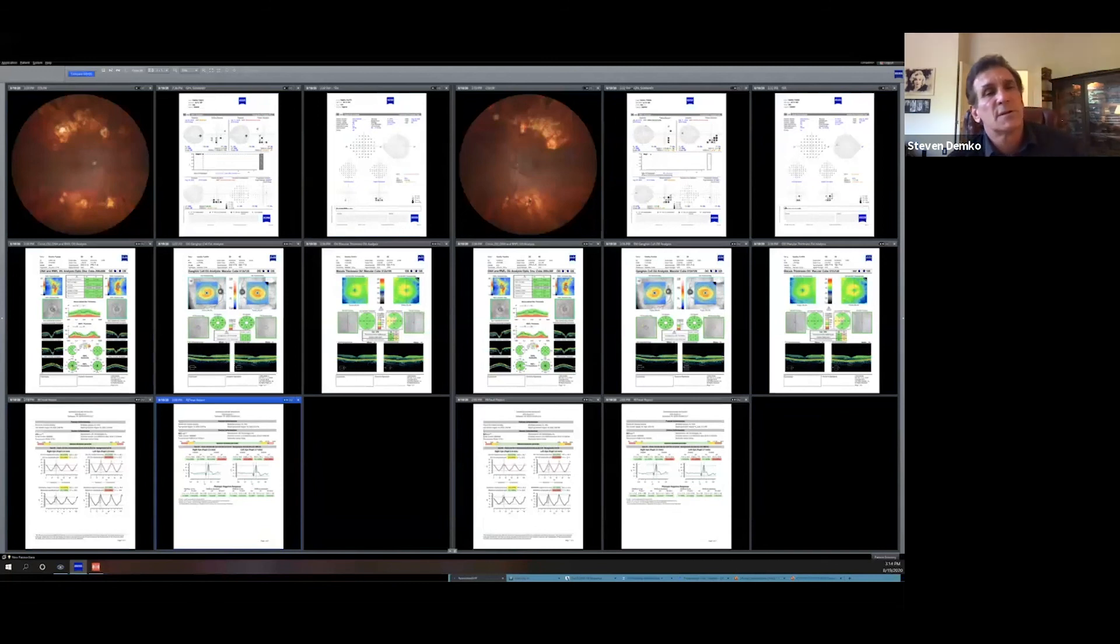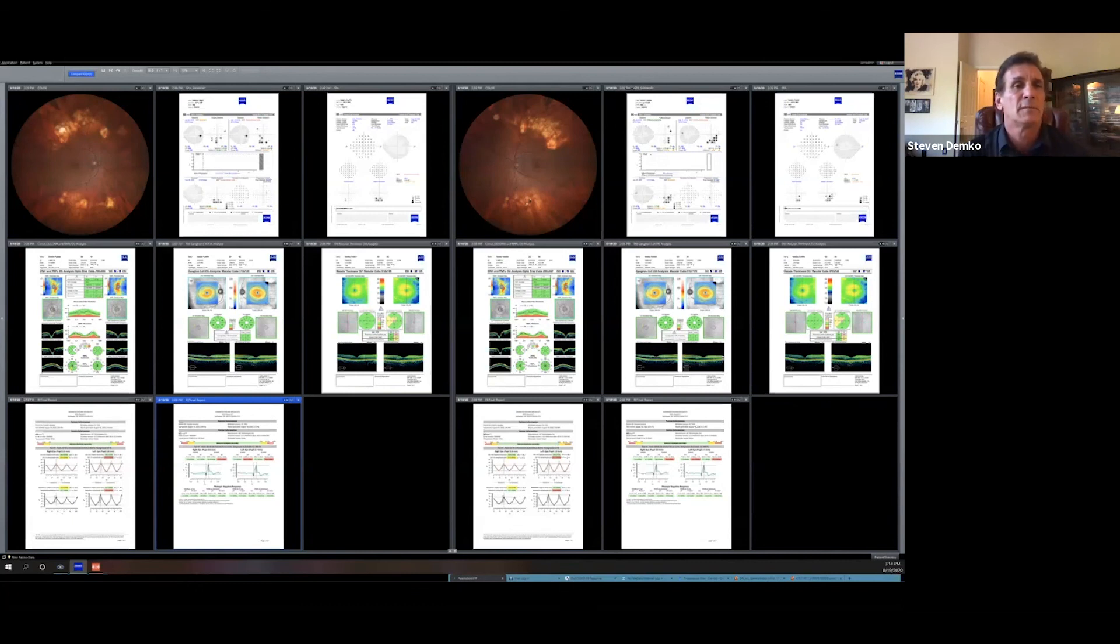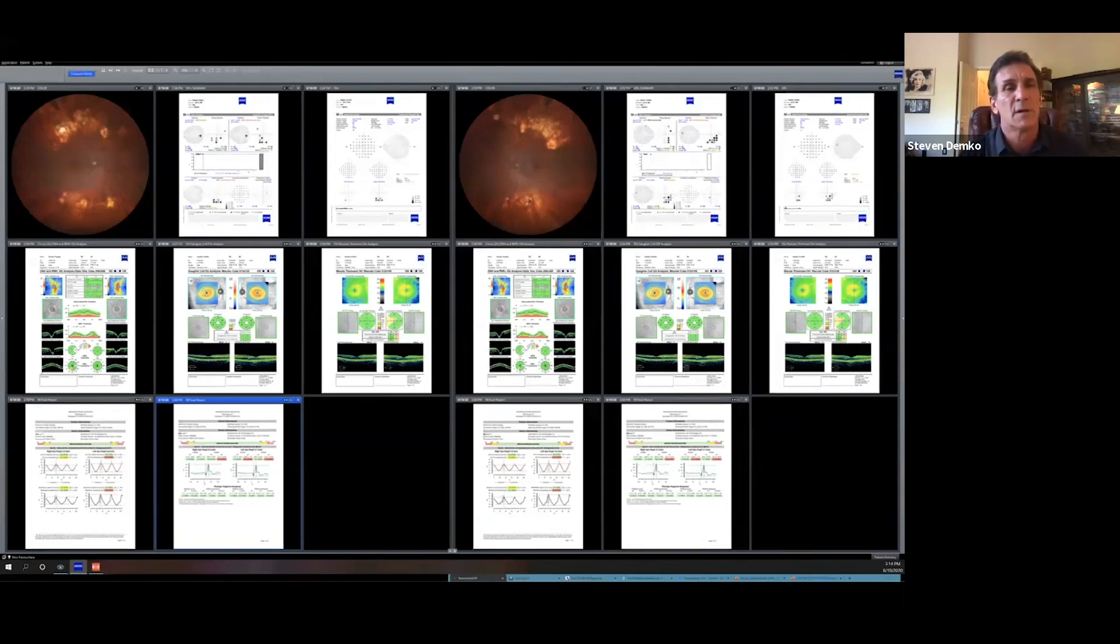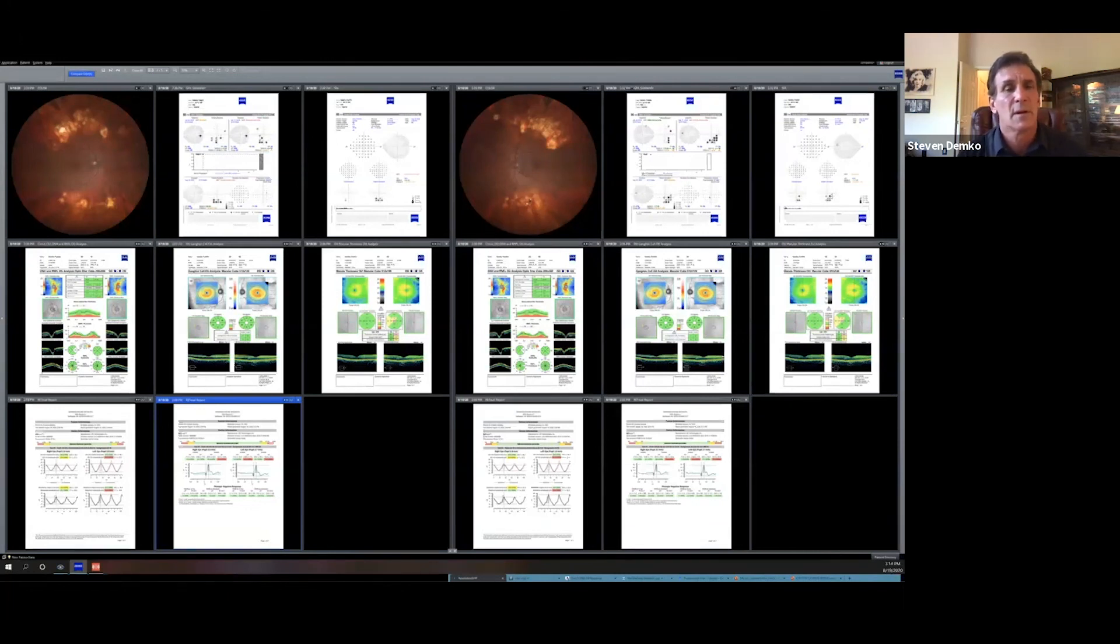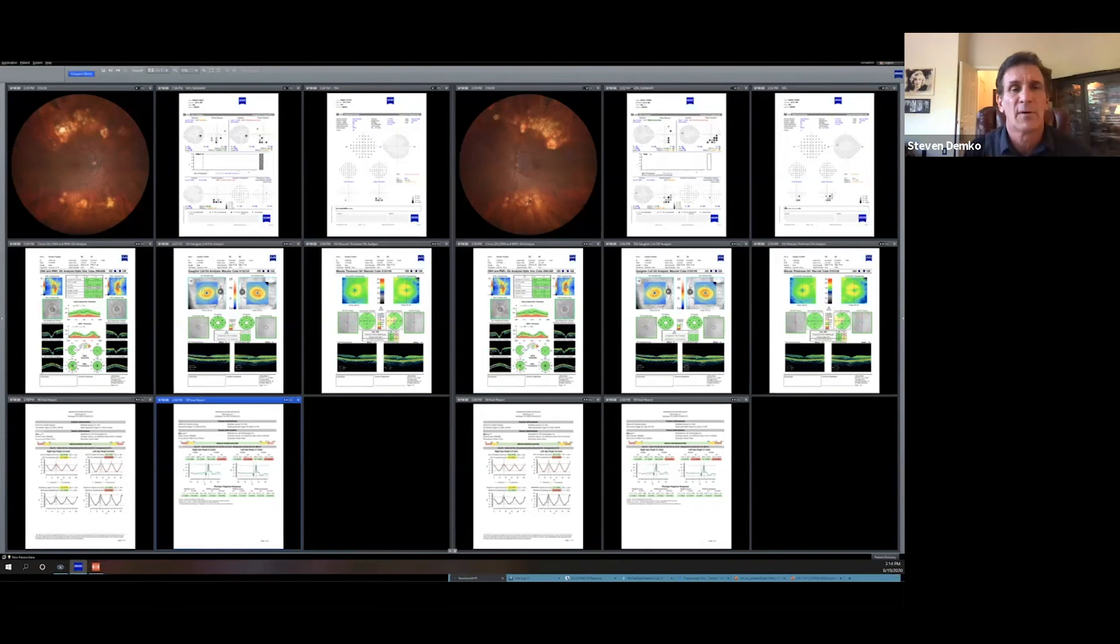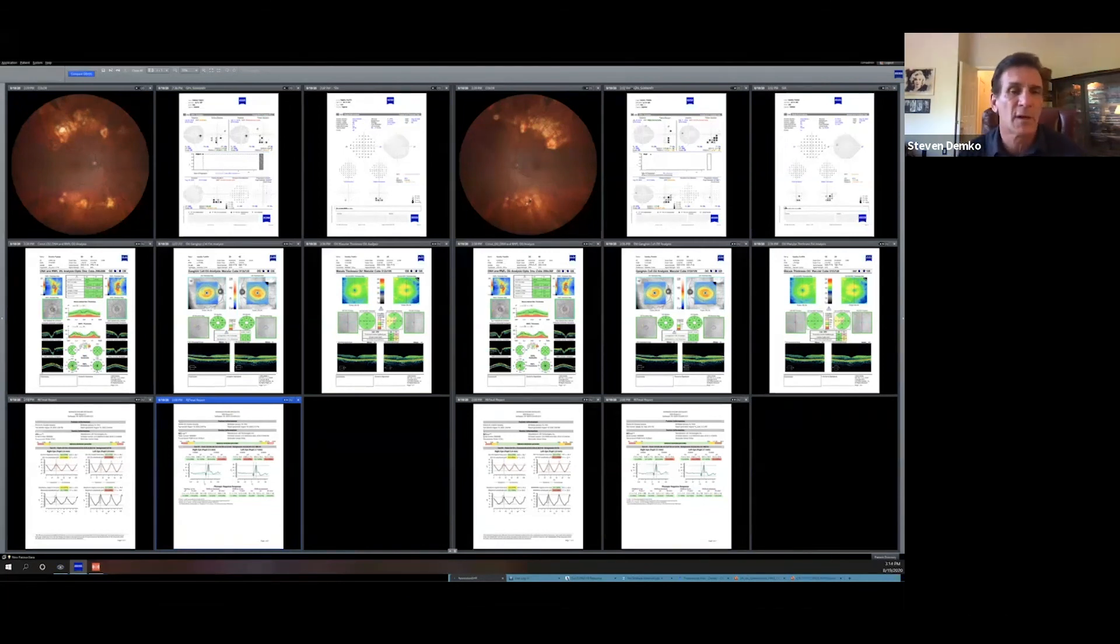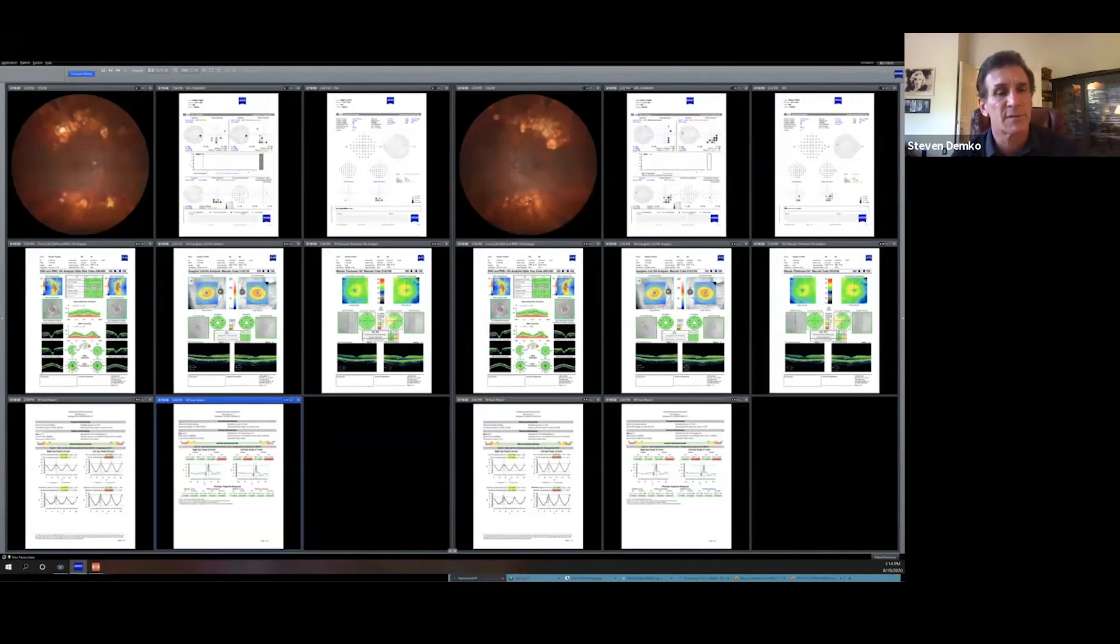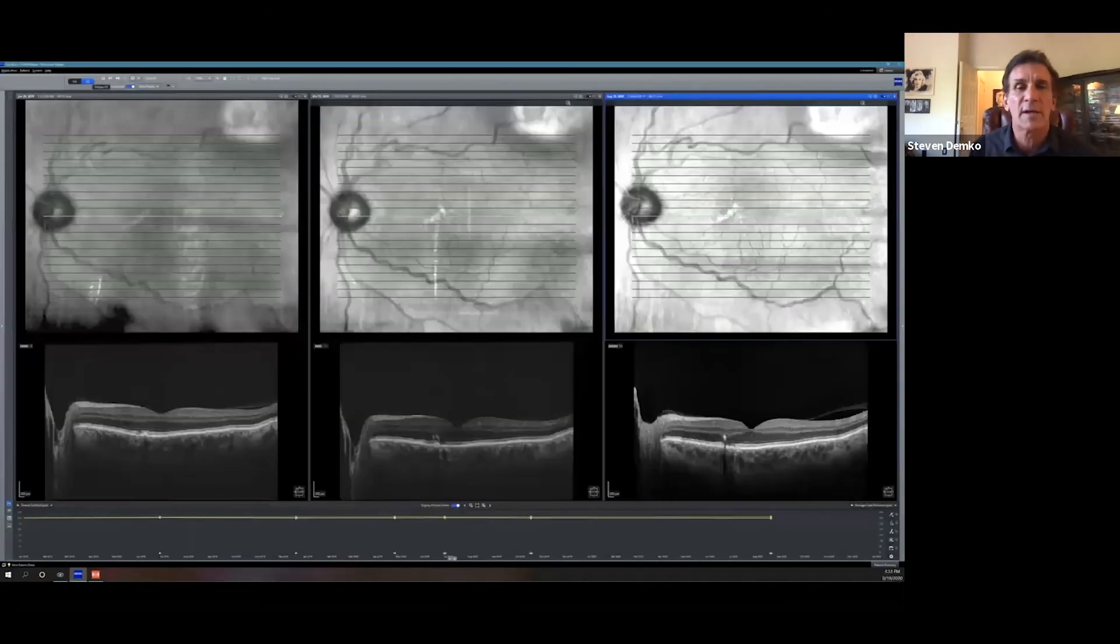So the patient is diabetic. You could see that he's had panretinal photocoagulation. Now I could click on that image on the top left and I can make that as big as a 55 inch screen. And I could magnify that to almost the nth degree to see if there's any further pathological conditions. And then I could compare that next to the visual field unit, which is right there. And he also was a glaucoma suspect. So you could see in the middle screen to the left that he does have some nerve fiber layer dropout. However, there's no ganglion cell loss. There were some changes in the macular cube indices. He does have some macular thinning on the left eye. And then below, you'll see that we did an ERG. It tells me that he does have a slight decrease in some of the functional aspects of this. And with another click, I pull up his previous ERGs. I compare those.